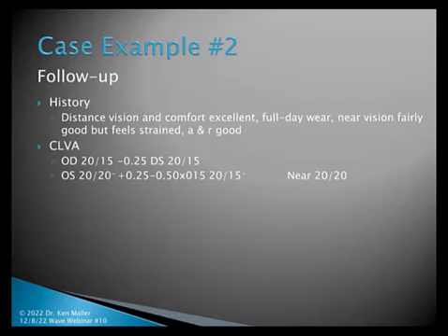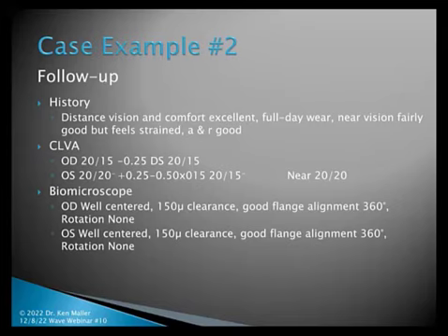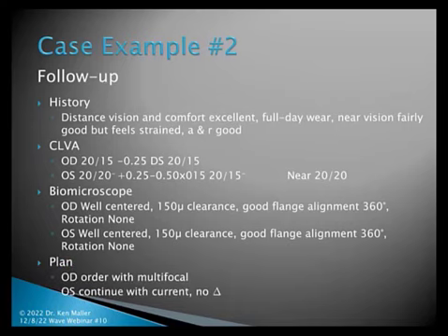So all that's very, very good. Assessing the fit, right eye is doing fantastic, and the left eye also fantastic. I decided to go ahead and order up the lens with the multifocal. The left one we continued with no changes at all since she's doing so well, and that was really to balance out just her near vision. I did get the multifocal for her. She's actually doing fantastic now with that.